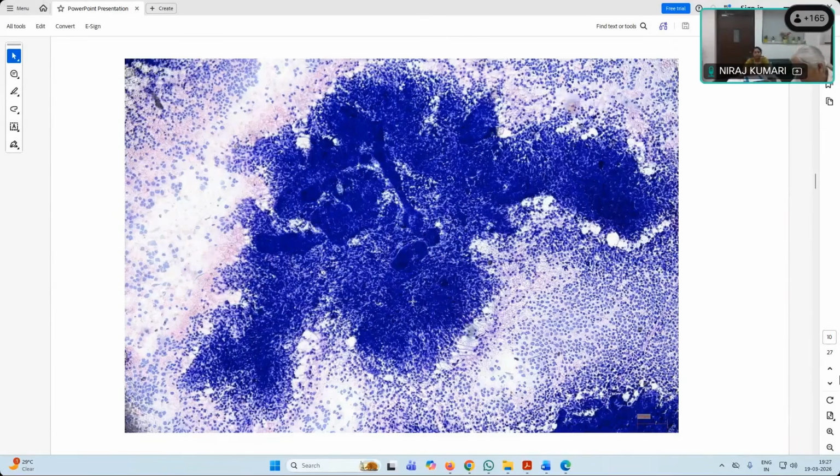Ma'am, congenital mesoblastic nephroma. Okay. So what is the morphology of a mesoblastic nephroma? Ma'am, we will see more of the stromal component, more of a spindle cell kind of morphology. Fascicles of spindle cells will be seen. Yes, so it resembles leiomyoma. So you get spindle cells, more of a mesenchymal cell population. Here you are also seeing this kind of cohesive sheets or tubules of epithelial cells, apart from these discohesive, dispersed round cells here.